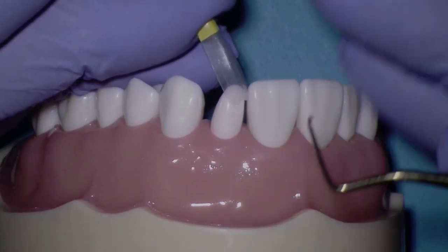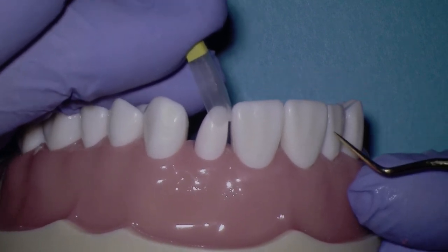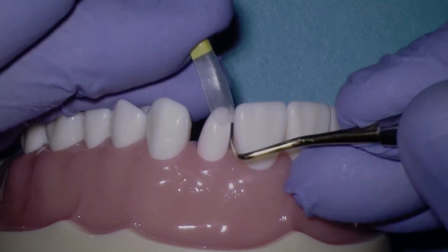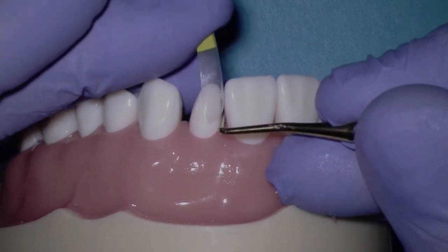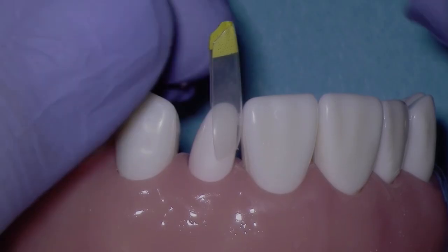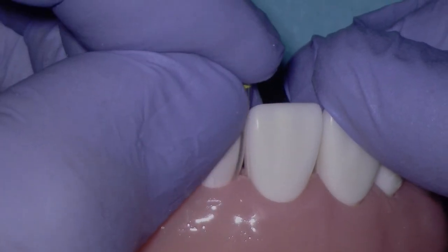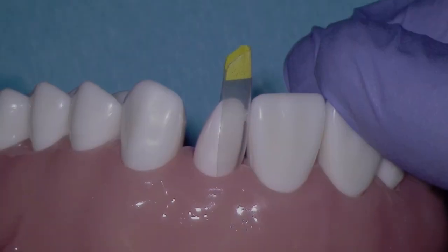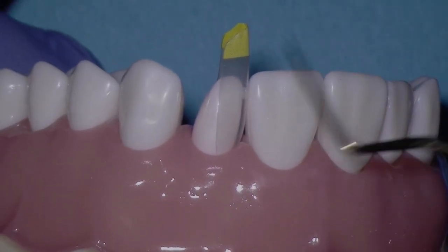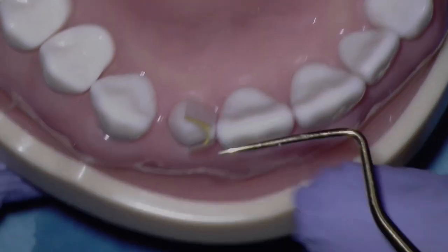Now I'll take my right hand and I'll pry open the contact just like we practiced a minute ago, and then we'll drop the matrix through the contact with my left hand. Now you should have good tension as you slide the matrix apically. It feels just a little bit like a black triangle now. Notice I'm pushing apically on the matrix and it's not bouncing back occlusally. So we know that that's a perfect direct contact strut. In the heart of the contact, occlusogingivally, buccolingually, it's exactly what I want to see.